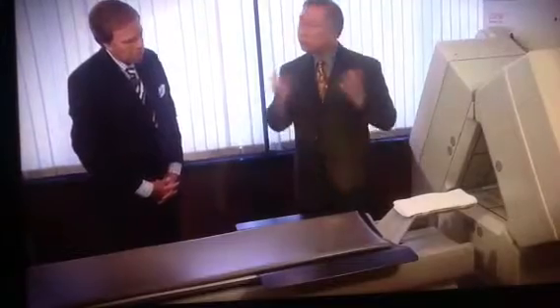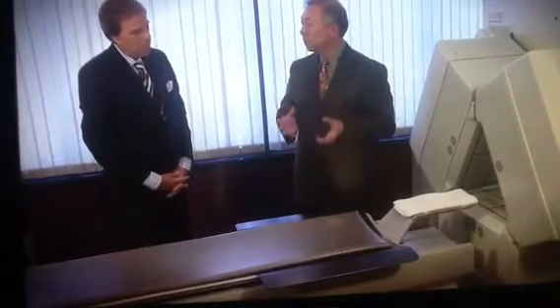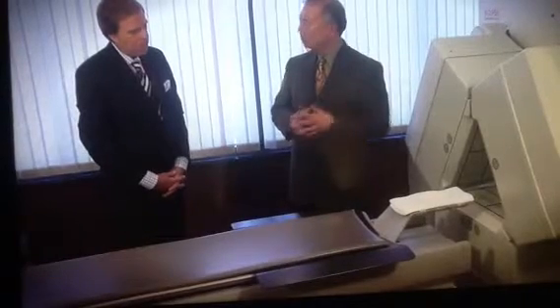brain. And then this is called a three-headed camera. Most SPECT scanners are what's called two-headed cameras, but this is actually an older model, and it's three-headed. Three heads are great because you get more signal, so the resolution is much, much higher. And I think that's one of the reasons why we can see the kind of detail we can see with the brain and the flow and all the different areas of the brain parenchyma that we can use to make the diagnosis.